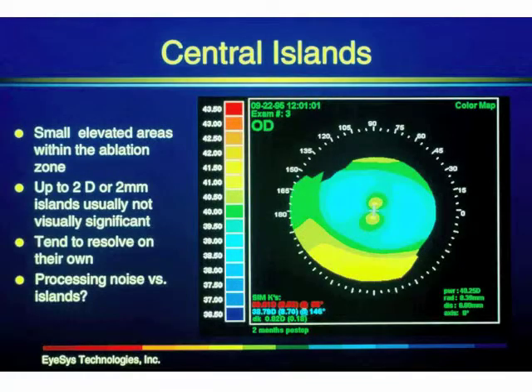And the picture that we're going to wind up with clinically is going to look like this, which is the slide that you saw right before this mushroom cloud, which is the island in the center of the cornea where the cornea is less ablated as it's passed through the stem of the mushroom cloud.